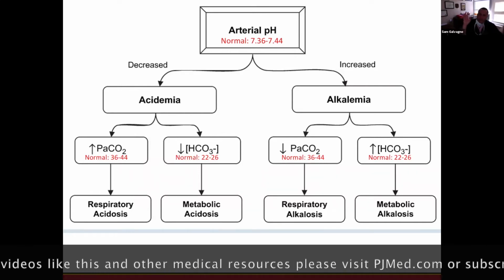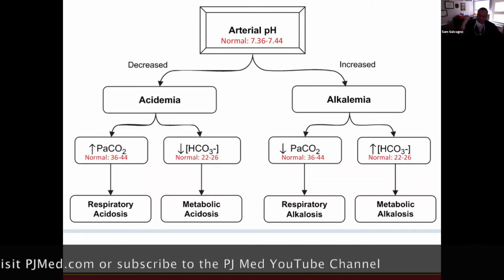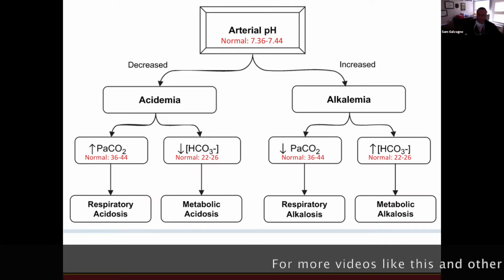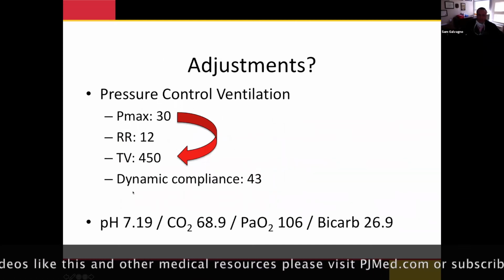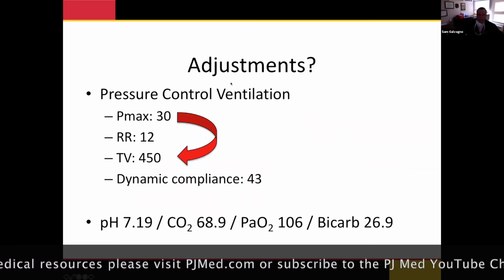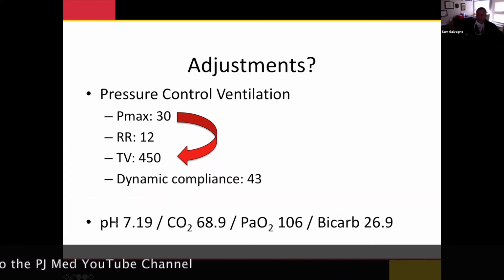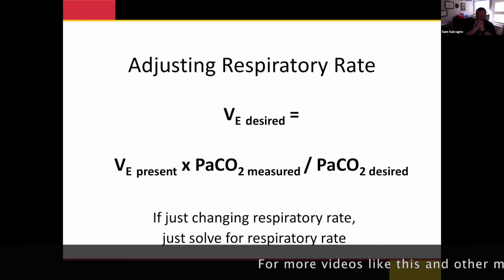If you calculate this stuff with the addition of your chem panel with sodium and chloride, and you're going to see when you do this on calculators on your phone, it's going to give you more detail, anion gap. We're not going to go there today. I just want you guys to get the basics. Because if you're sitting there and your intensivist wanders off and has to take care of 4 other patients, and you're stuck with this, you can make an immediate intervention on this basic data. And the intervention is going up on the respiratory rate. It's that simple, okay?